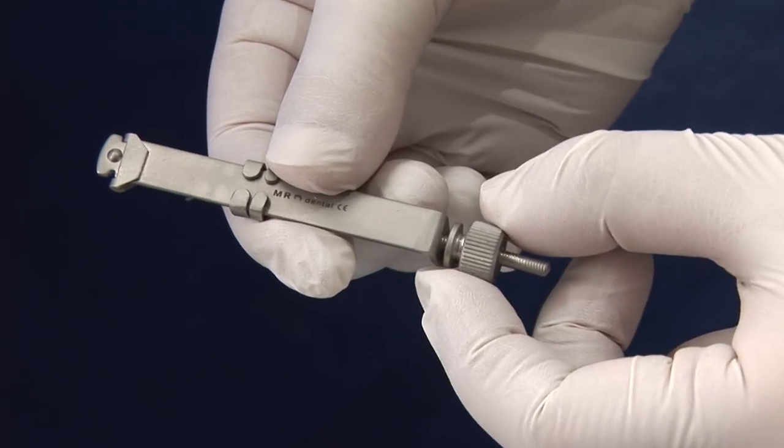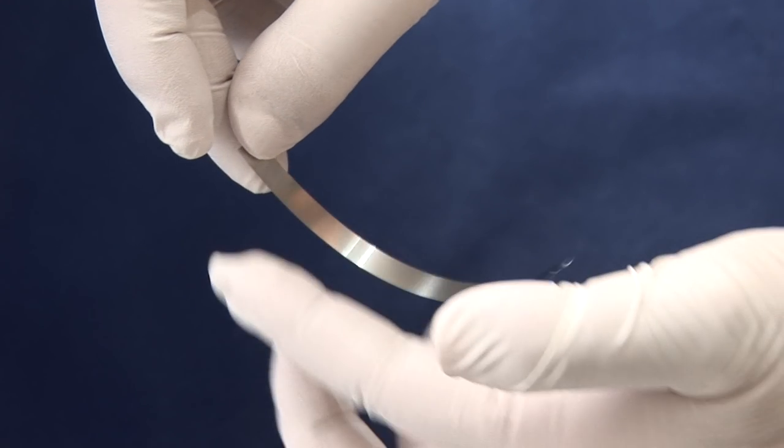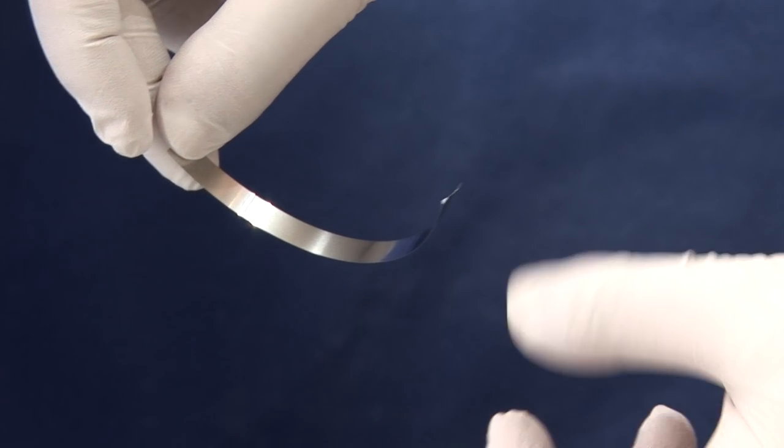This is the nut that makes a matrix band wider or smaller. The length of the matrix band should be the same length as the matrix retainer.